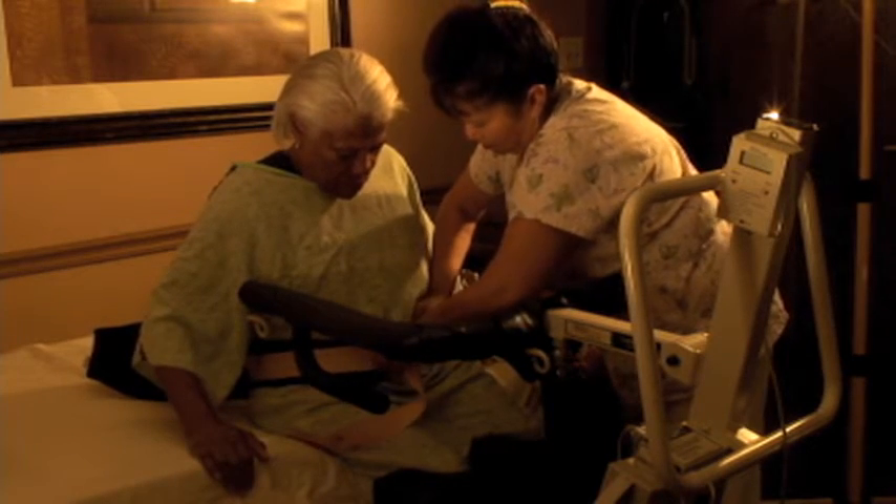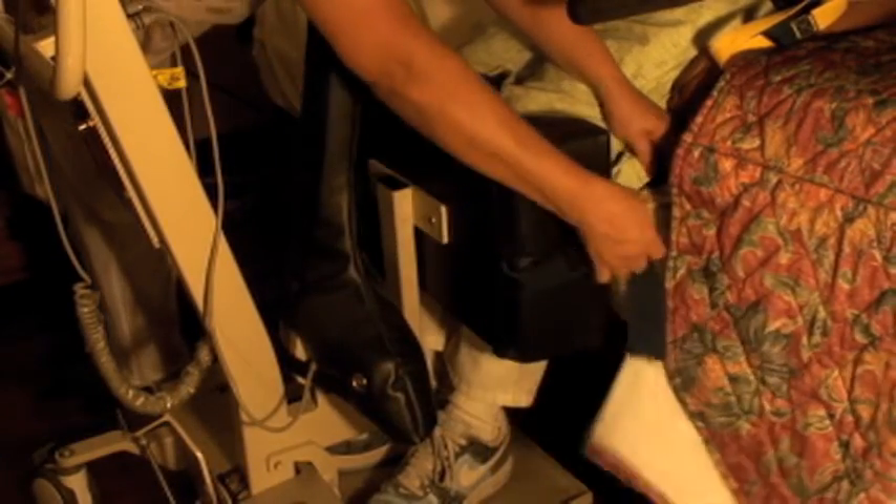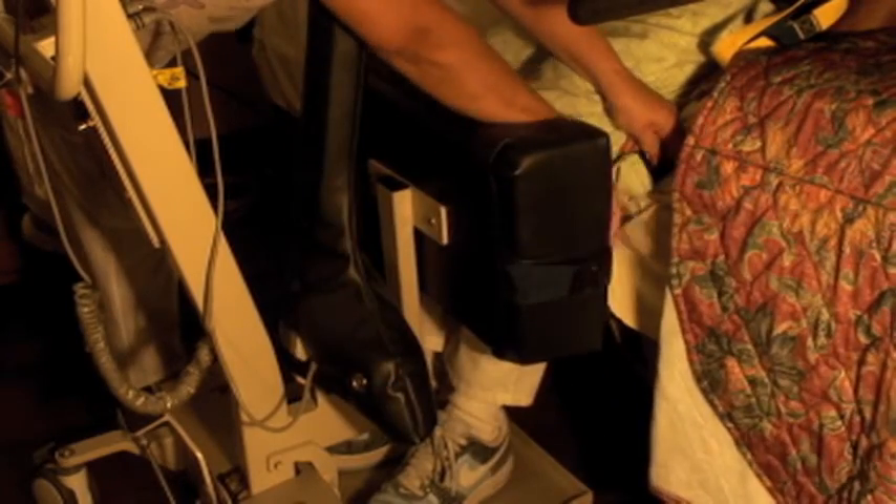There are three settings to choose from. The post highest on the bar is for thin residents, the middle one for moderate residents, and the post closest to the end of the bar is for heavier residents — choose appropriately. After hooking one side, bring the belt low across the resident's back, and finish by hooking the other end of the belt to the appropriate post on the unhooked side of the lift.